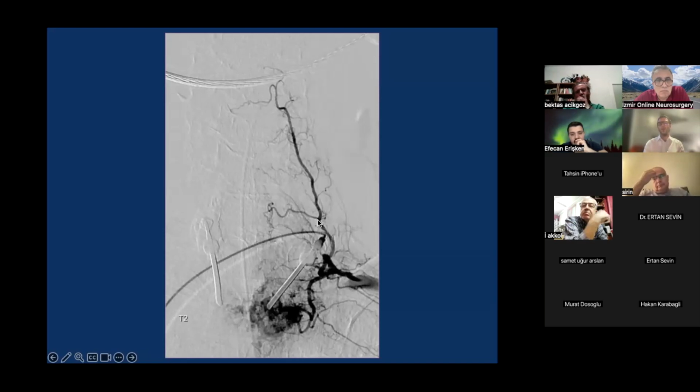Here you see the deep cervical artery, and I'll remind you that the deep cervical artery usually gives rise to a radiculomedullary artery feeding the anterior spinal artery, and here you opacify the right subclavian artery. So here, if you inject the alcohol, you will have alcohol which will go everywhere in the subclavian artery, so you will kill the patient or have a very, very severe complication.